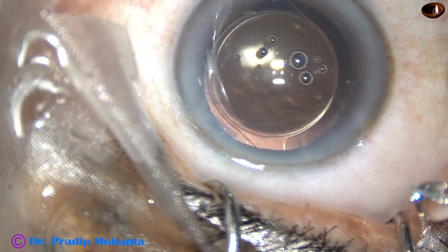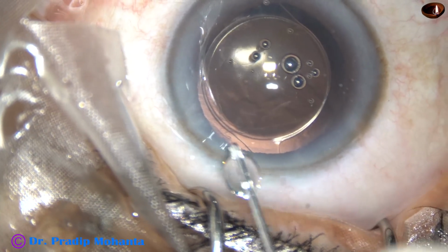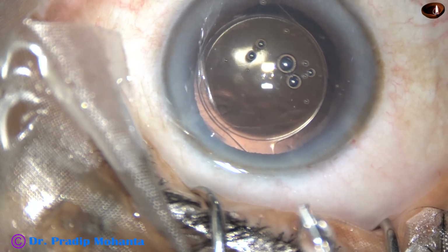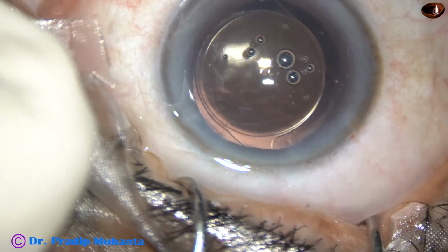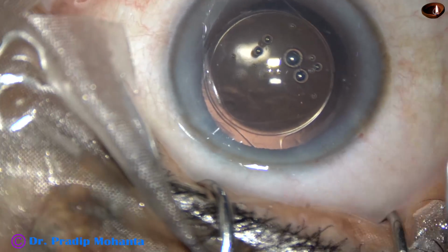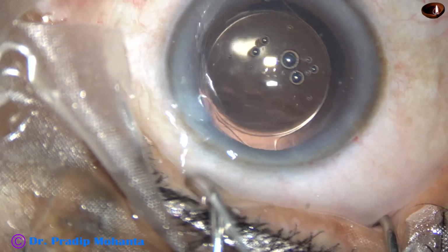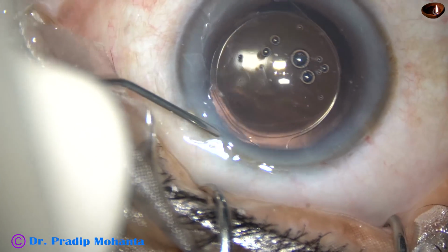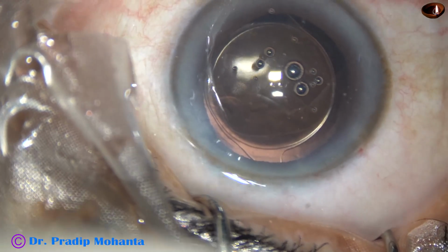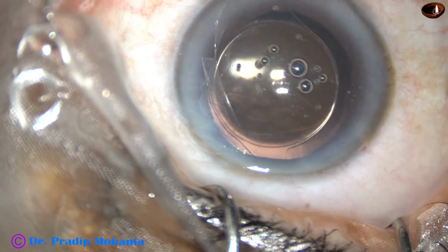And now I inject some moxifloxacin and then close the side ports by corneal stromal hydration. This is corneal stroma on either side of the stab wounds, and thus the side ports are hydrated and closed.